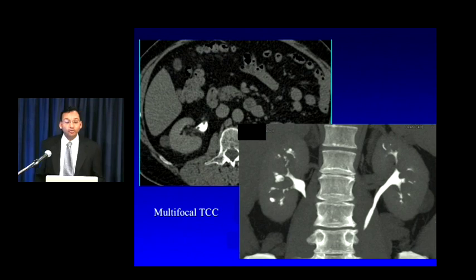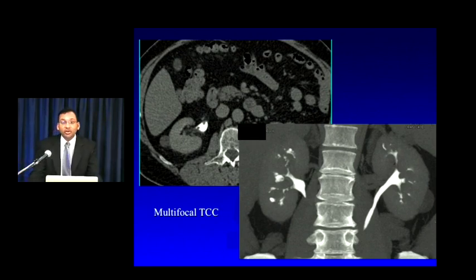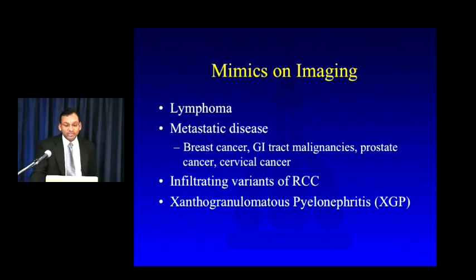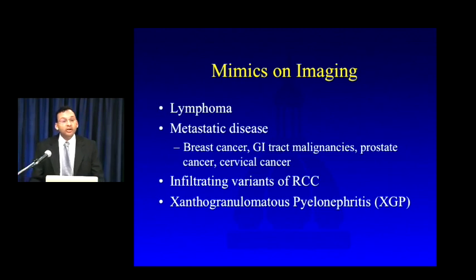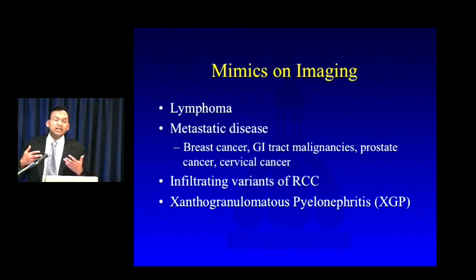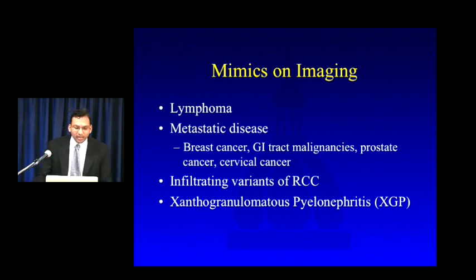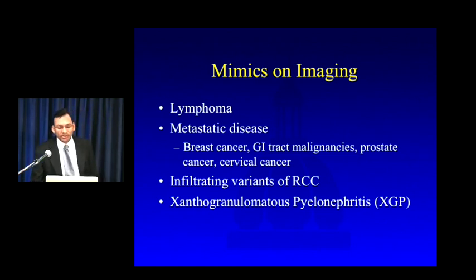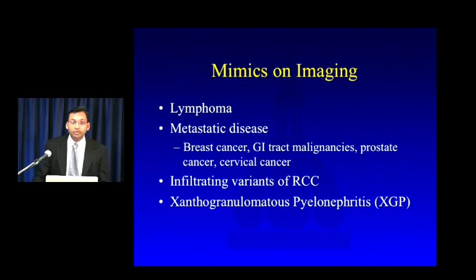Here's an example of extensive multifocal disease, with at least two nodules visible on a single axial slice within the renal pelvis, and on coronal MIP reconstructions from the excretory phase, extensive lesions throughout the right collecting system and possibly the left as well. Not everything that looks like TCC necessarily is — the most important mimic is probably lymphoma, which can look very similar as an ill-defined infiltrative mass but is typically associated with other stigmata of lymphoma such as lymphadenopathy. Metastatic disease and infiltrating variants of RCC can also mimic TCC, as can xanthogranulomatous pyelonephritis.